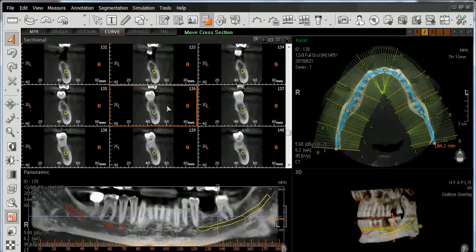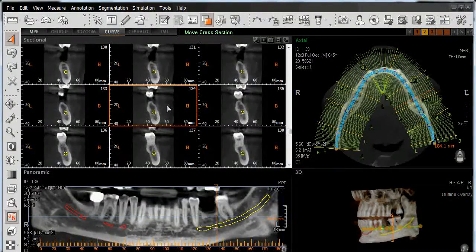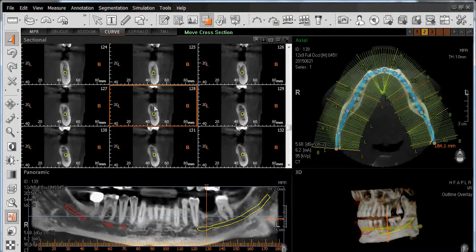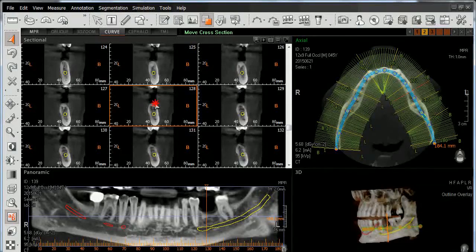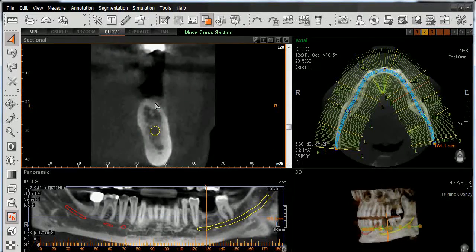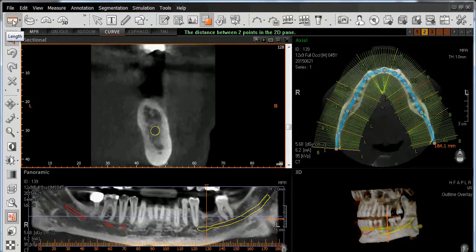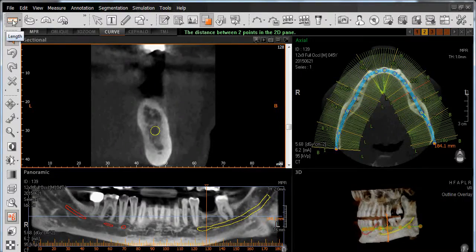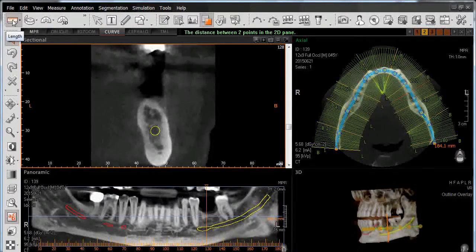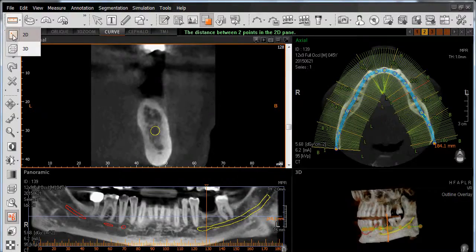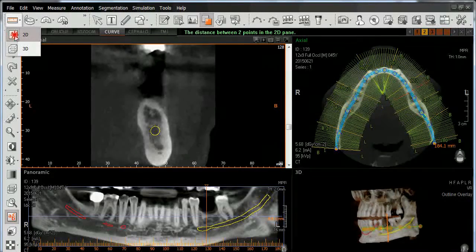Let's navigate to the site where we're going to place our virtual implant. Once I've identified my site, I'll double-click on this sectional view to expand it in size, and then access the measurement tool located in the upper left-hand corner. Left-click and then left-click on 2D.